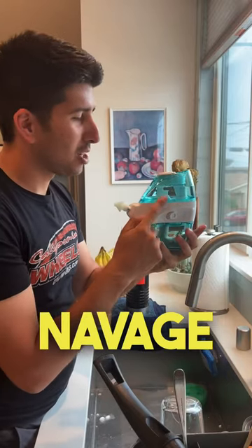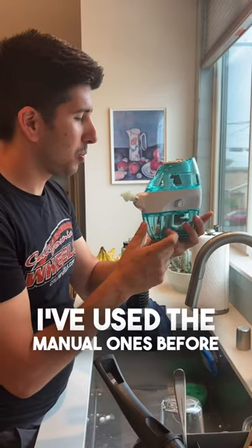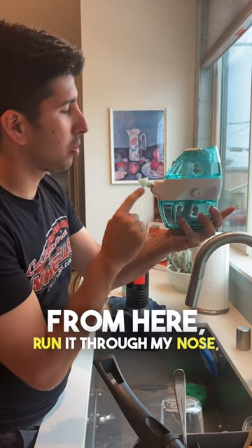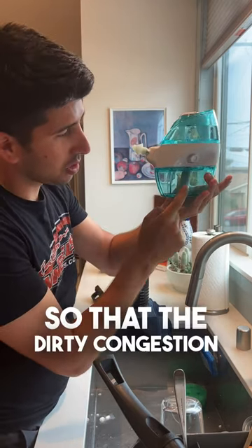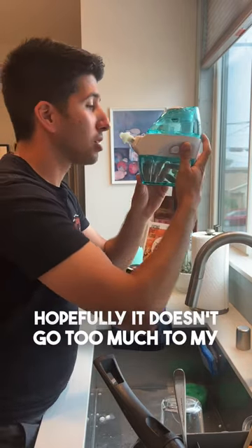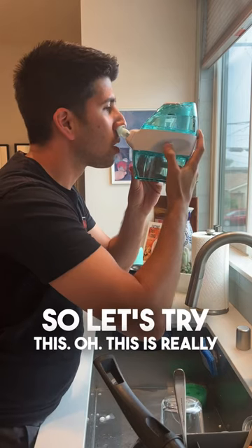This is my first time ever using the Navage Nasal Irrigator. I've used the manual ones before, and I'm very curious how this works. It's going to take the water from here, run it through my nose, and then it has suction so that the dirty congestion water is going to end up down here. Hopefully it doesn't go too much to my brain, so let's try this.